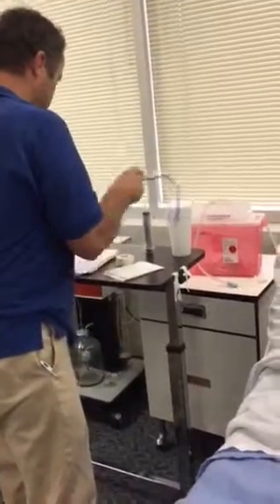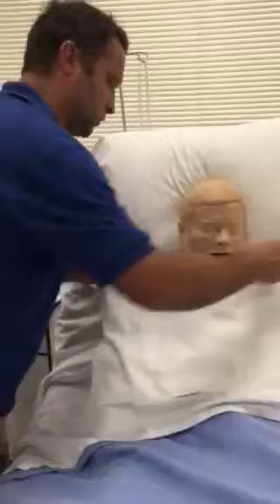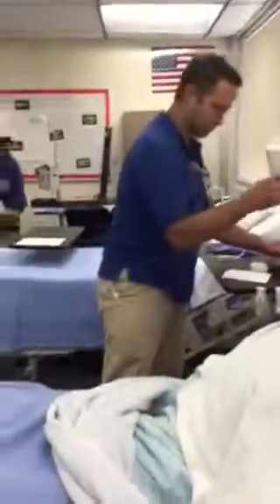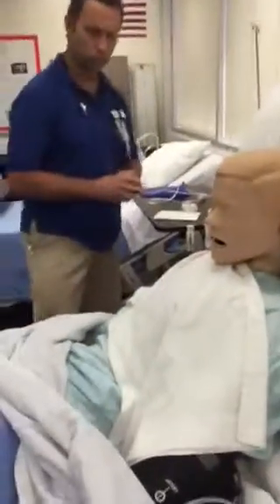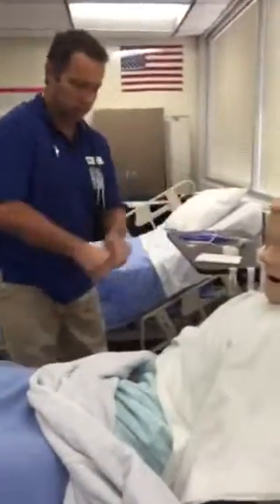All right, first I'm going to begin by labeling. We're going to put a little towel here across him just in case we get a little messy. Very good. All right, I have prepared a little cup of water for him so he can swallow when we're inserting the tube. All right, I'm going to put on some gloves.